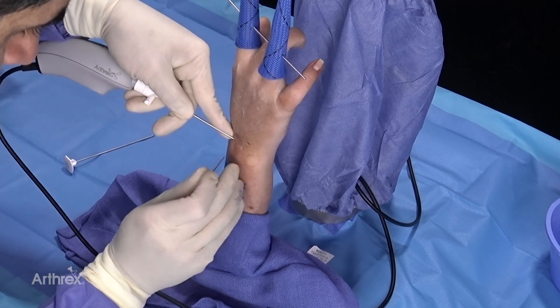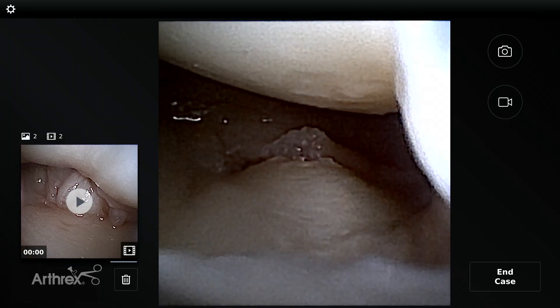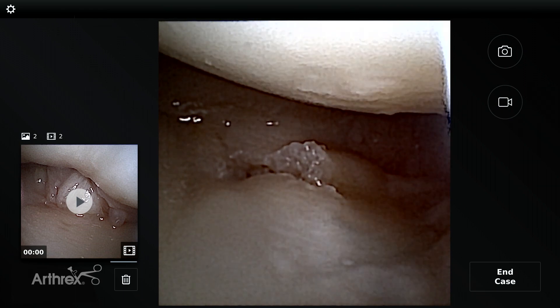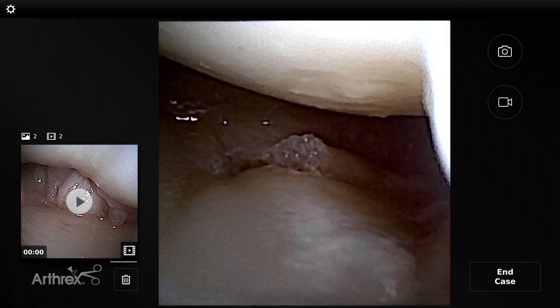Remember we had a radial tear, and now what I've done is I've taken a needle — and you can see I'm underneath the TFCC. The nanoscope has given us the ability to get into a very tight spot with extreme accuracy, knowing that I'm underneath the TFCC. You can see the needle is now marking my portal for the DRUJ.